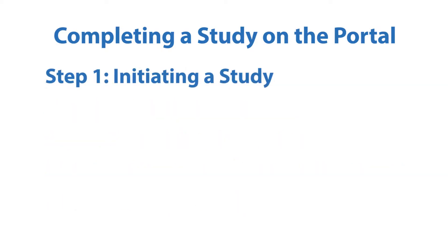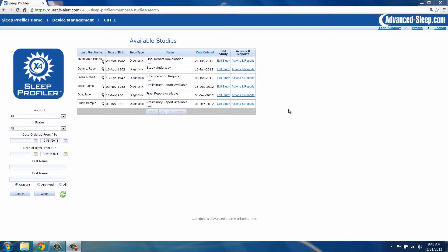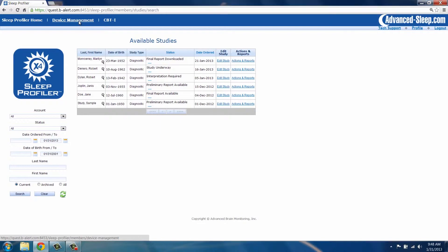Step 1: Initiating a Study. First, patient information must be entered to initiate a study. To do this, on the Sleep Profiler homepage, select the Device Management button.